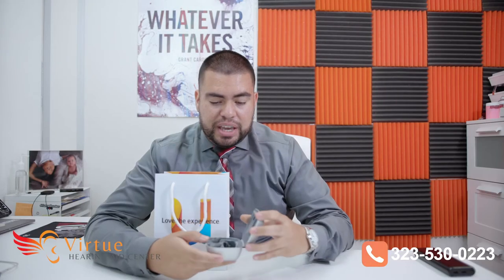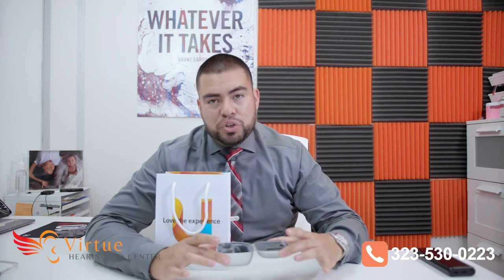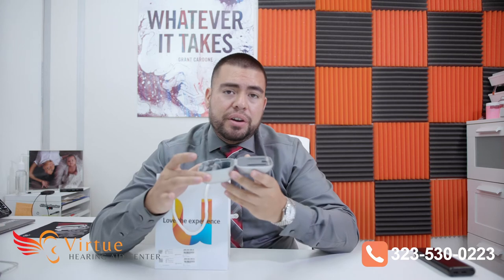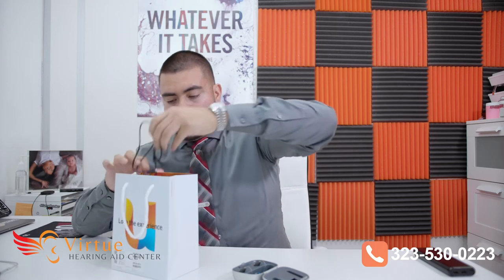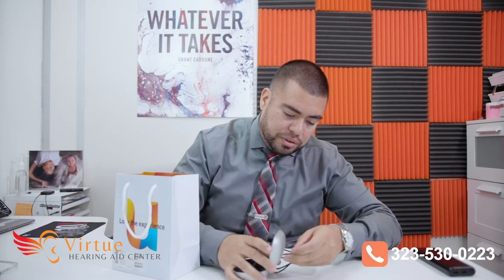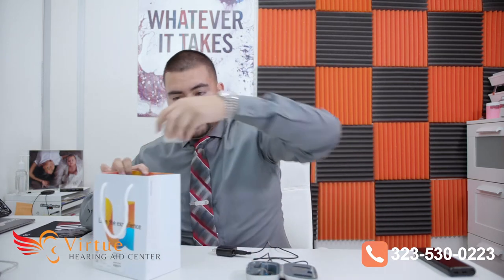We have first here the case where the hearing aids come in. This case is special because not only can you put your hearing aids in here, it's a rechargeable case as well as a dehumidifier case. Let me show you — it also comes with charging cables that plug in right here to the back.